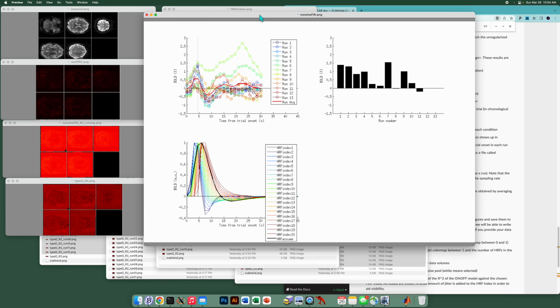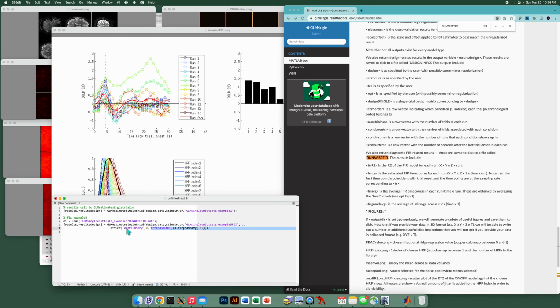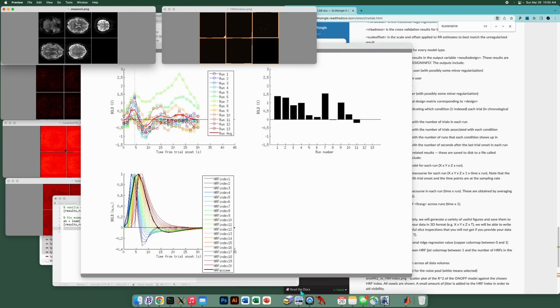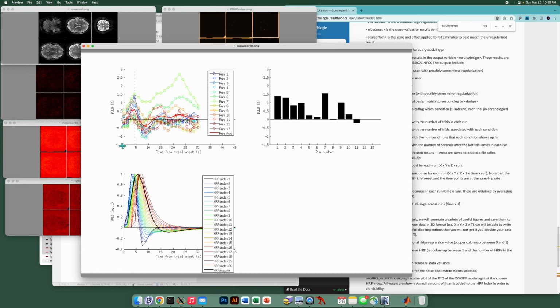Now, there are many other approaches you could use. You could tailor the library, only use the first several, and you can do that by appropriate use of the flags that you call GLMestimatesingletrial with. Here we just did a sort of brute force, crude approach where we just turn off the library and just use a single HRF, namely this red time course here. Now, it turns out these results are peculiar to this subject. Other subjects run on this exact same experiment did produce figures that showed very strong, very good signals.